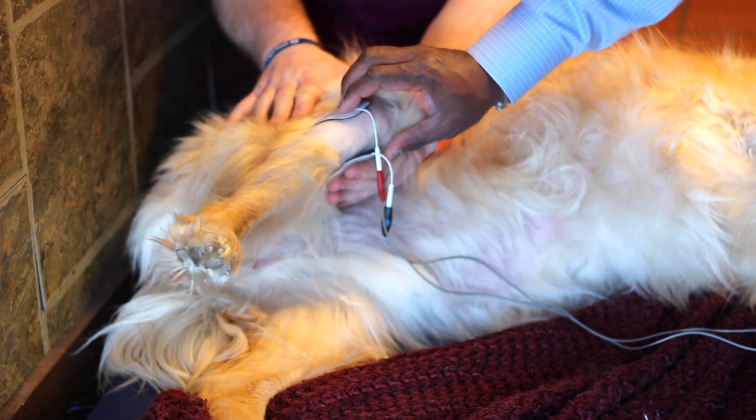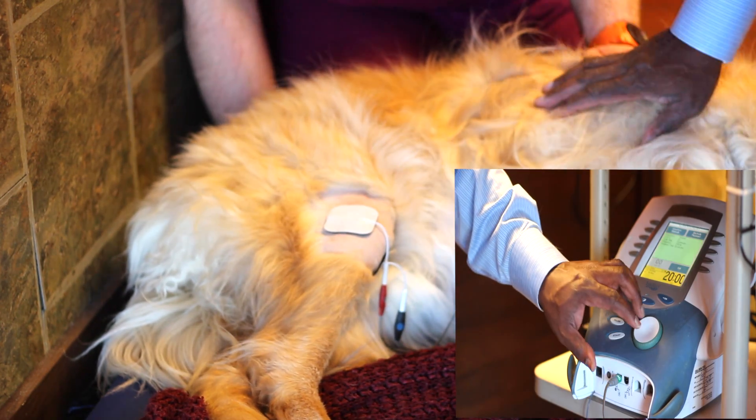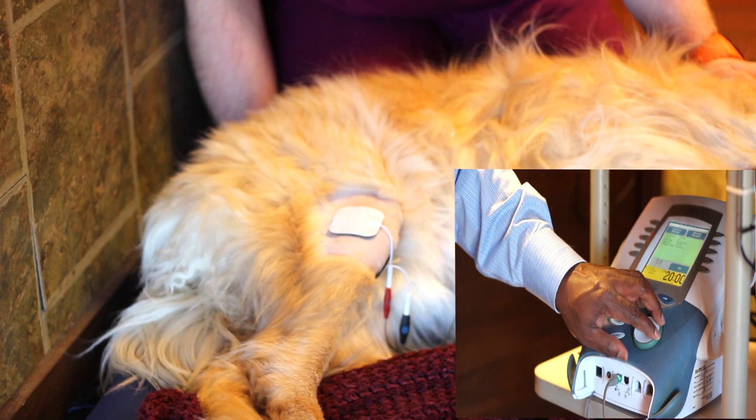We place one electrode across each end of the joint, and then we're going to use the Intellect Vet here to set the current.